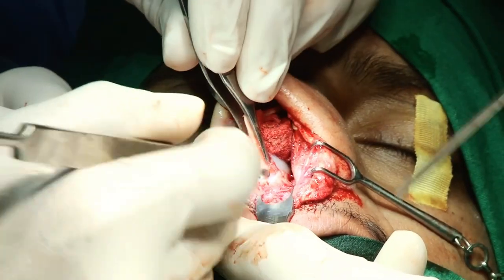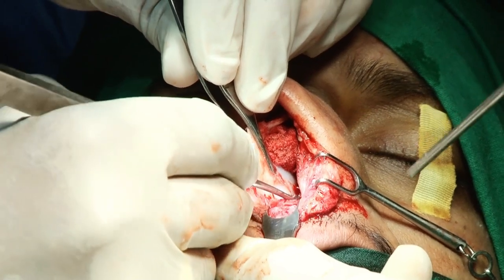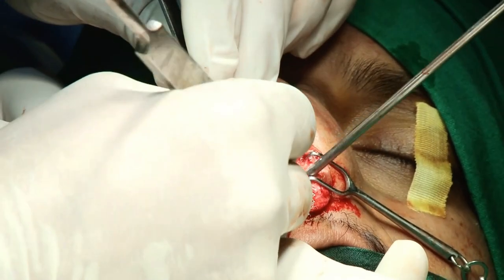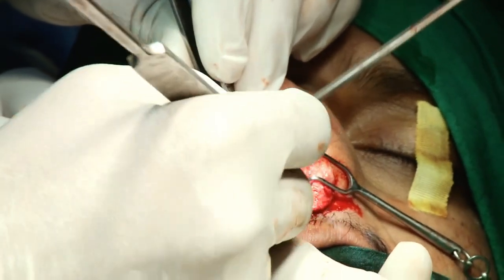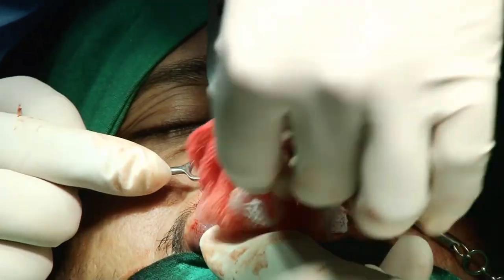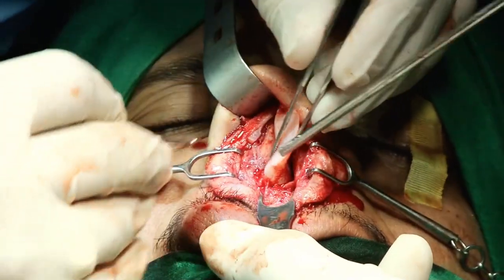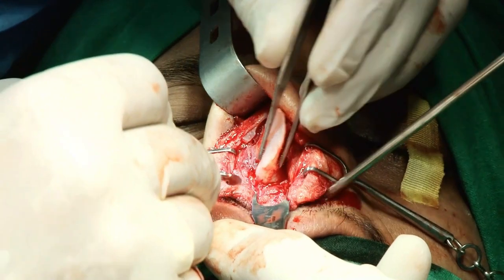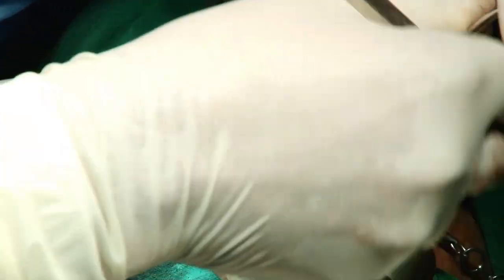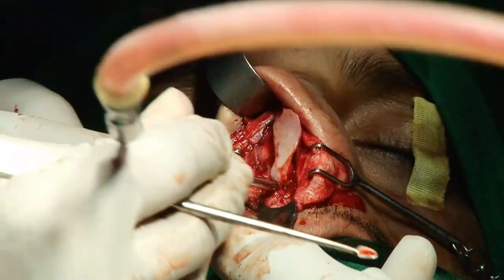I will show you two sutures, but I think it's necessary to put in this particular case minimum two. Can you give me 5-0 by 2? Usually I do five or six, but in this particular case I will show just two. Give me 5-0 by 2.